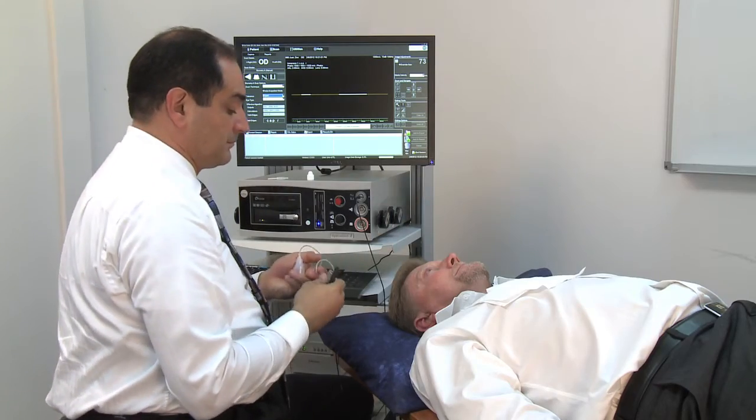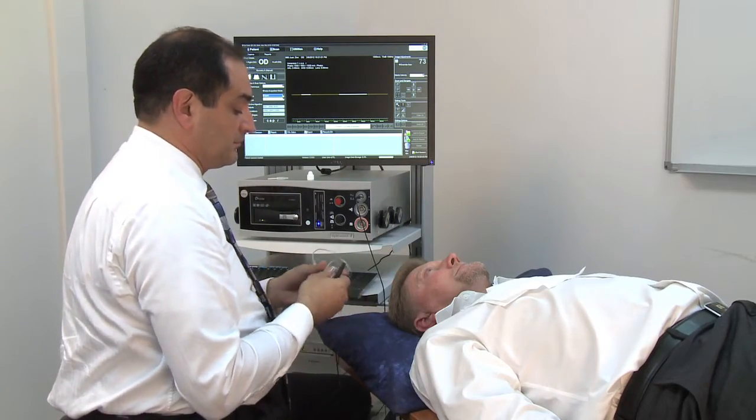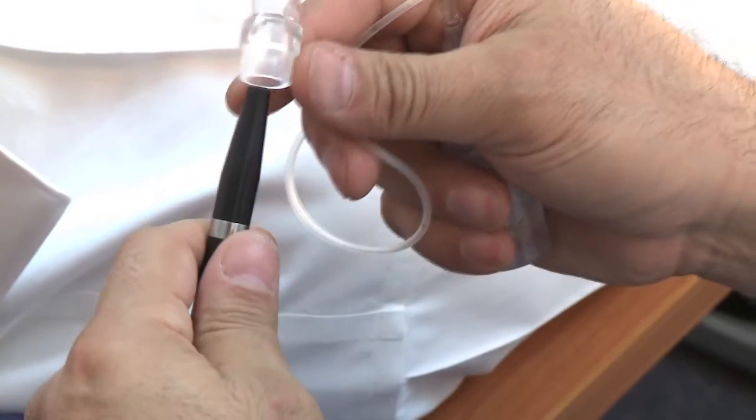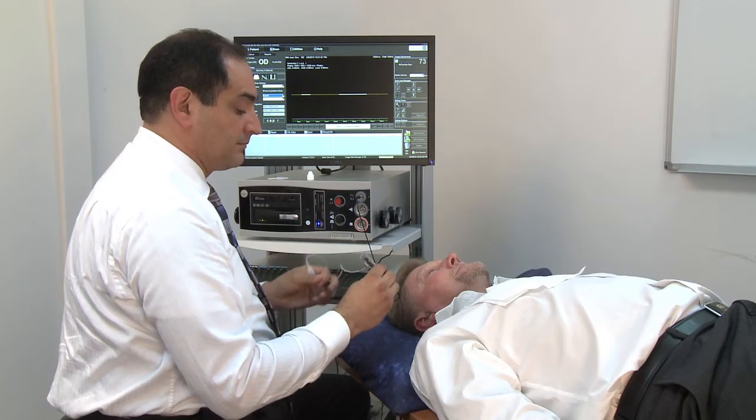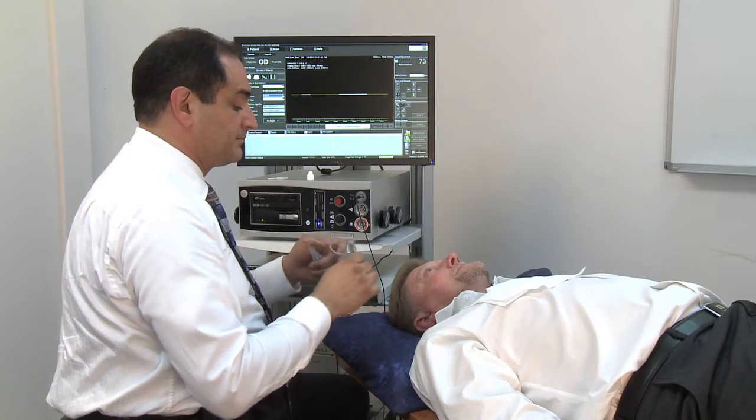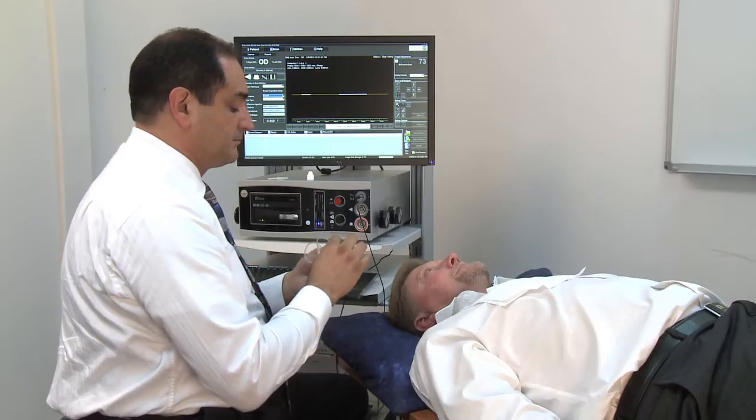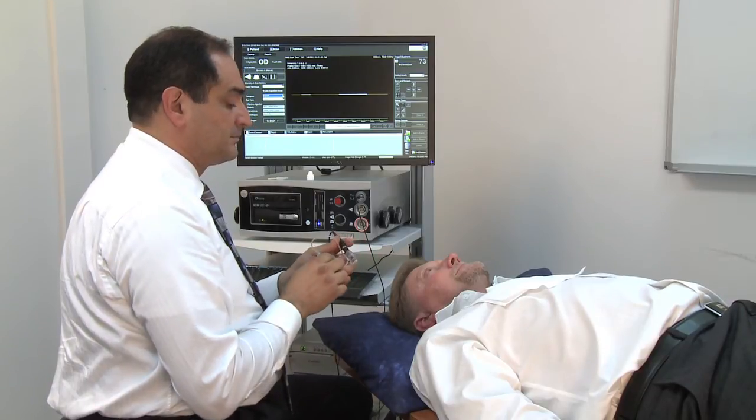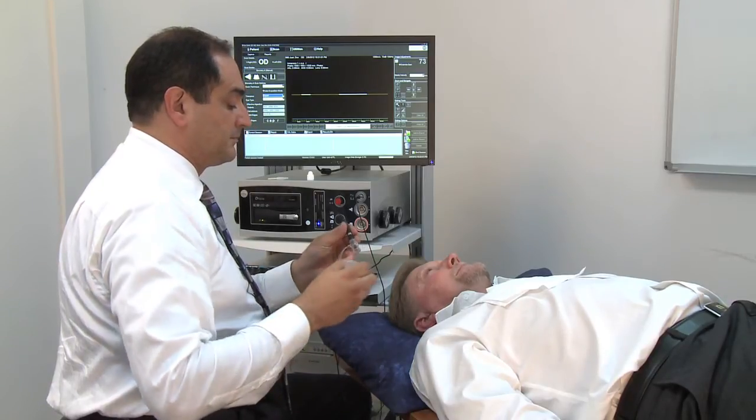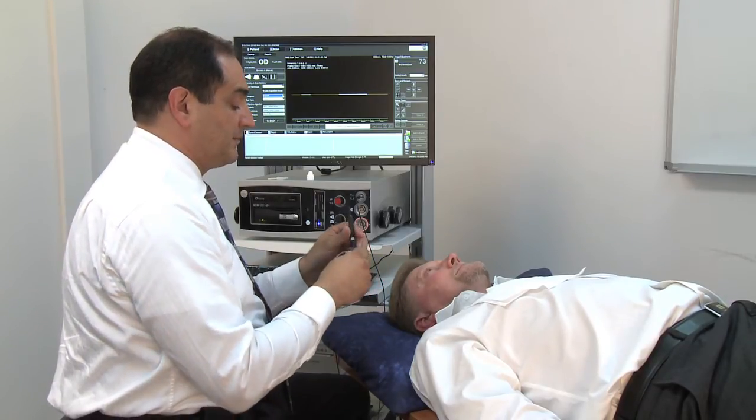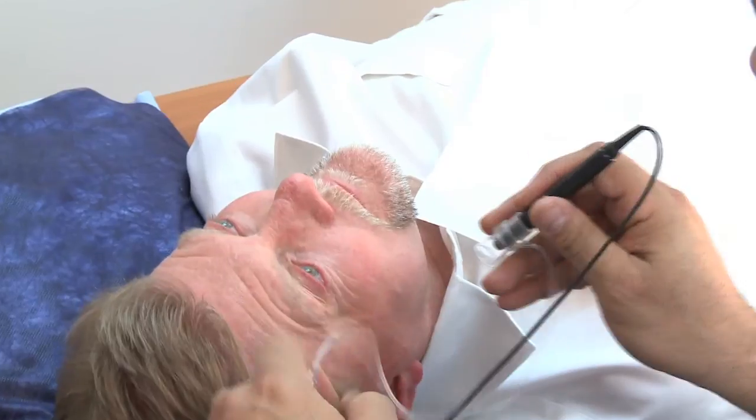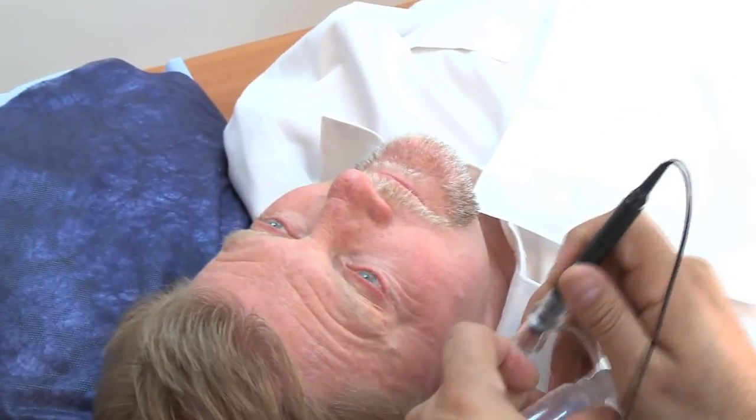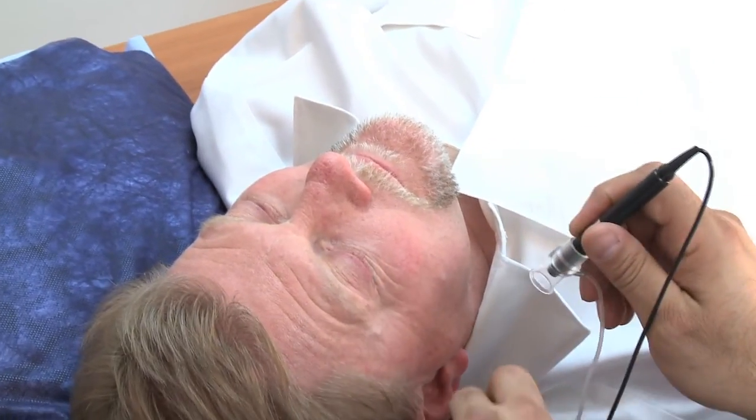Place the probe in the shell, ensuring that the fixation light is on. Place the flanged end of the shell on the patient's eye so that the eyelids hold the shell in place.